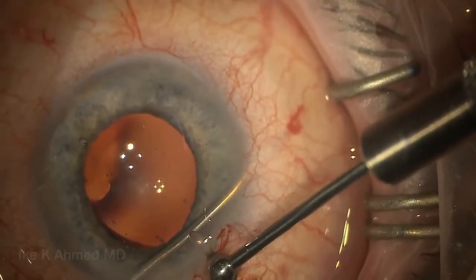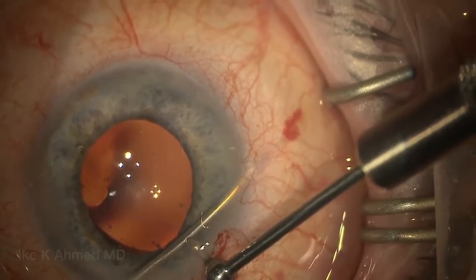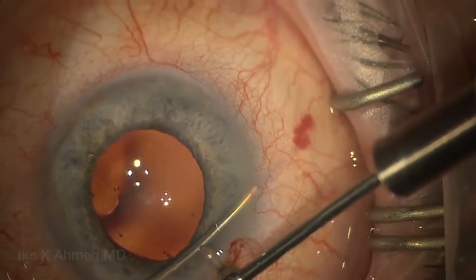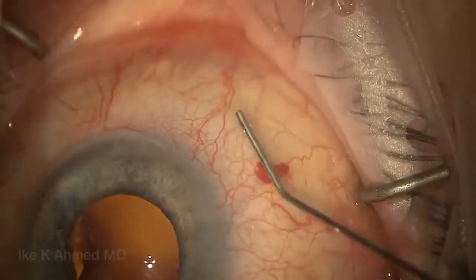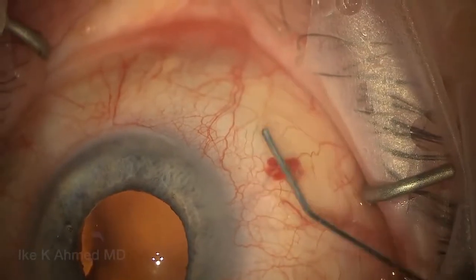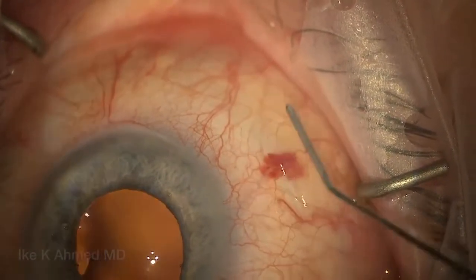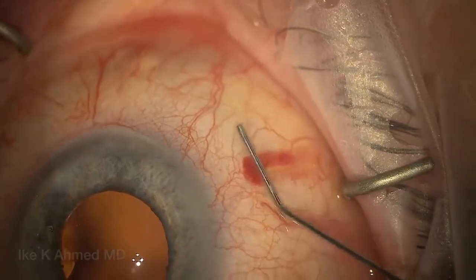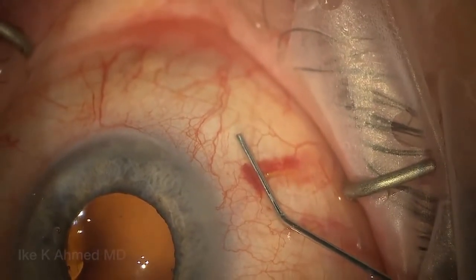The deployment slider is passed forward. The needle is retracted into the cannula after the implant is passed forward. Once the needle is into the cannula, we relax our hand for a second, take a pause, and then pull back without flicking the cannula to avoid retraction of the device into the eye. Sometimes there's a small heme at the exit site of the implantation — putting some pressure on for about 30 seconds really helps provide hemostasis and prevent expansion of that hematoma.